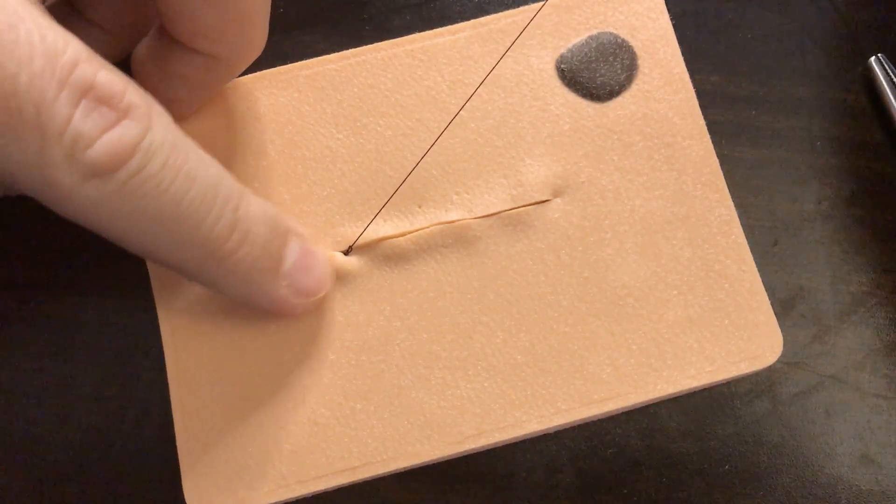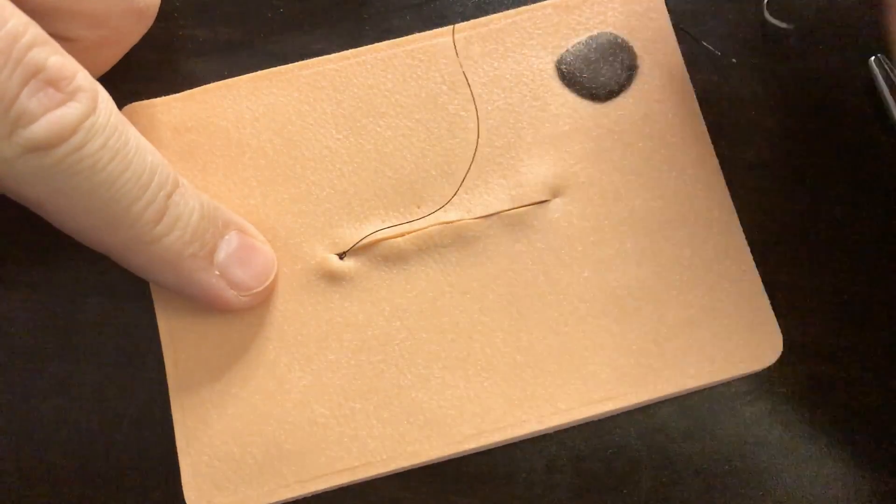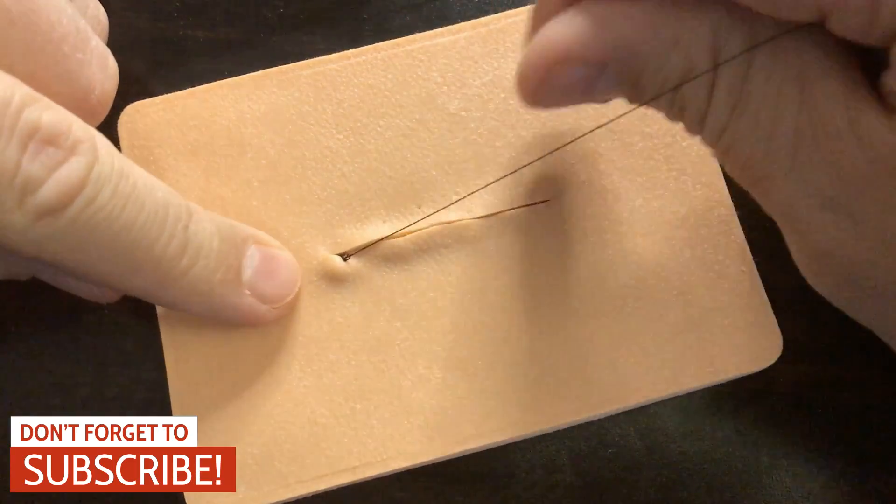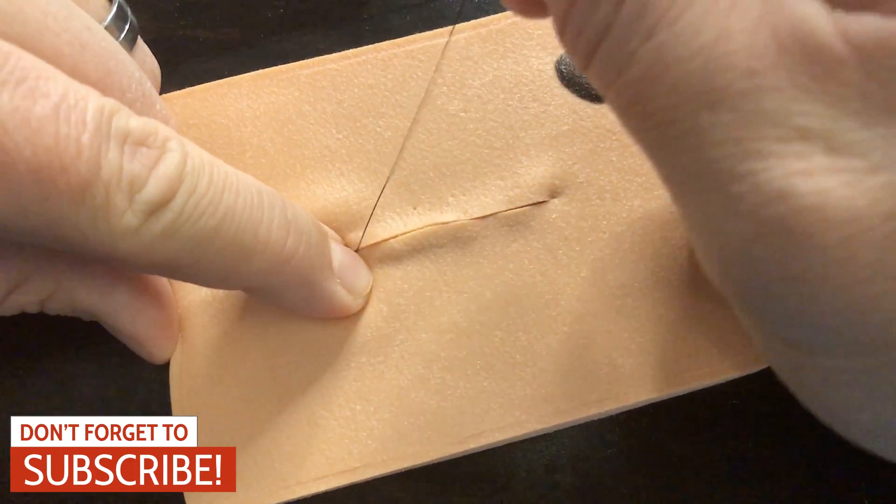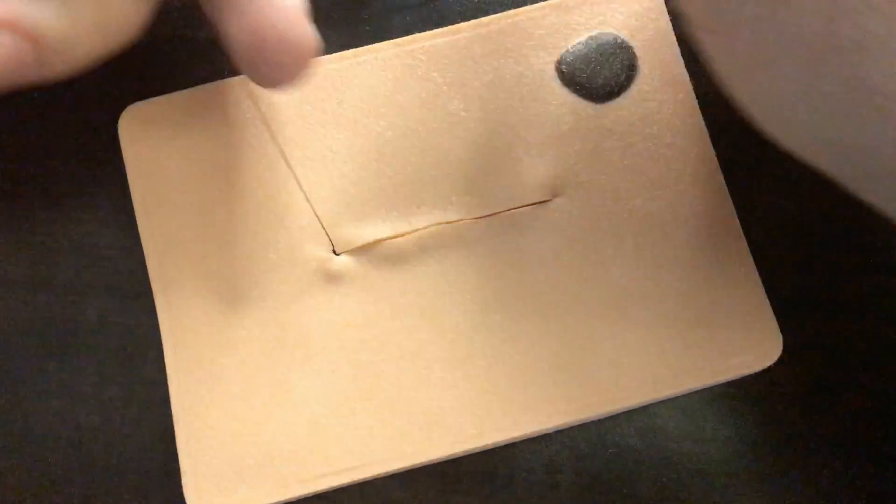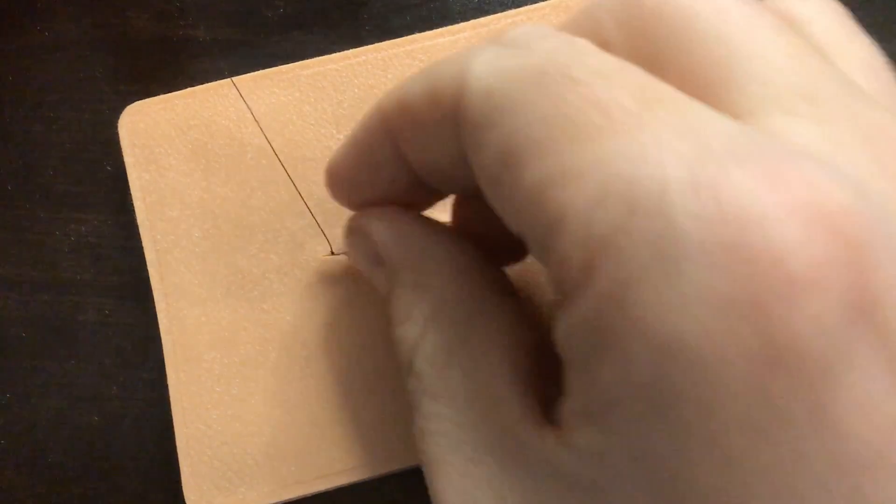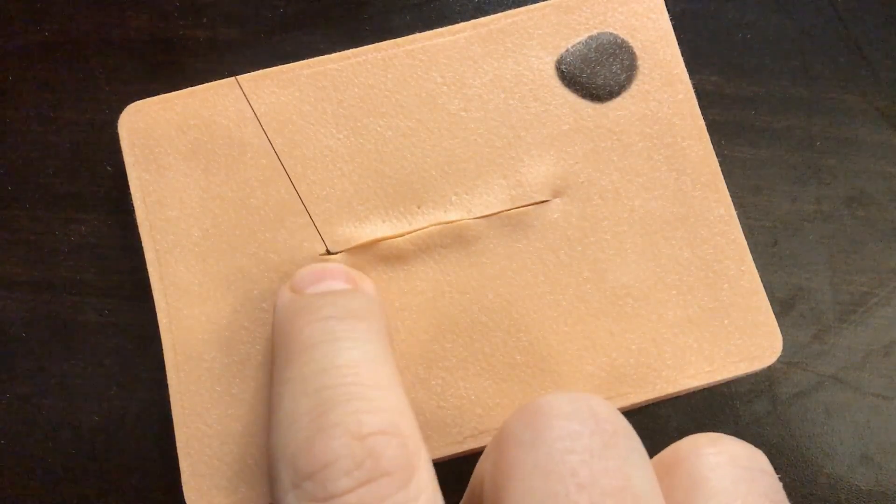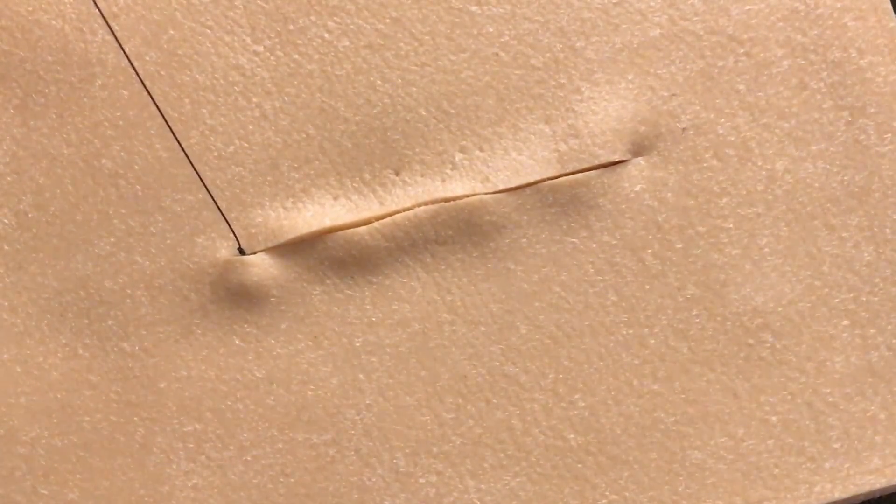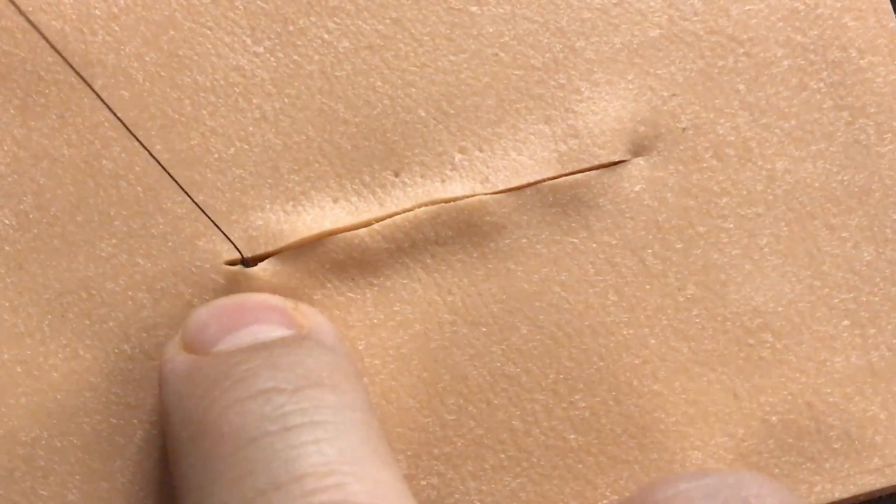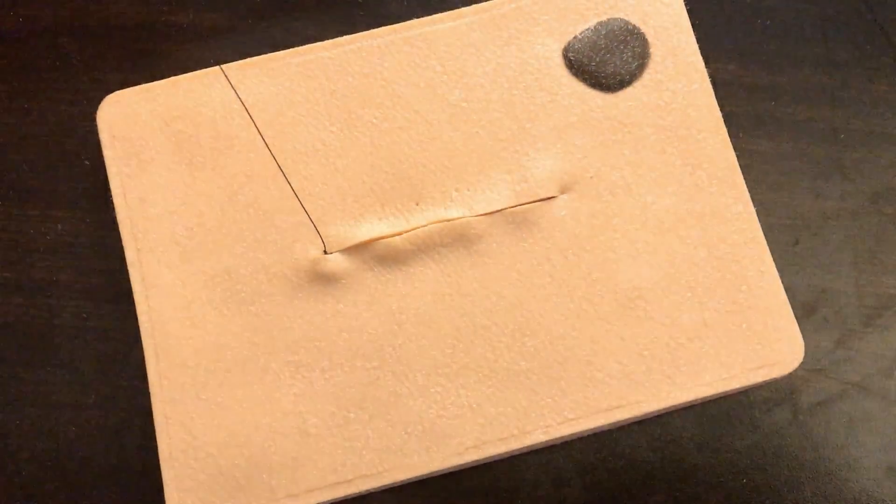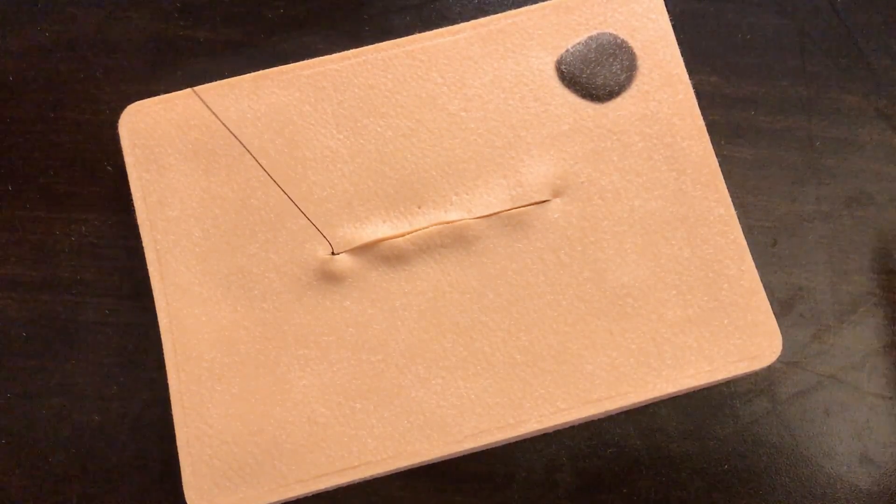Now don't pull too hard because remember with a subcuticular suture, you're passing the suture through tissue that's not very strong anyways. So I'm going to use my other finger to kind of brace it as I pull that knot, wiggle it a little bit, get some tension there. So there we go. That was the Aberdeen knot, but now we've got a little bit of an issue here because if I zoom in here, you can see right there I've got the knot that is poking up through the skin and that's going to prevent this from healing. Well, I've got to bury that knot. So let me show you how you're going to bury that knot then.